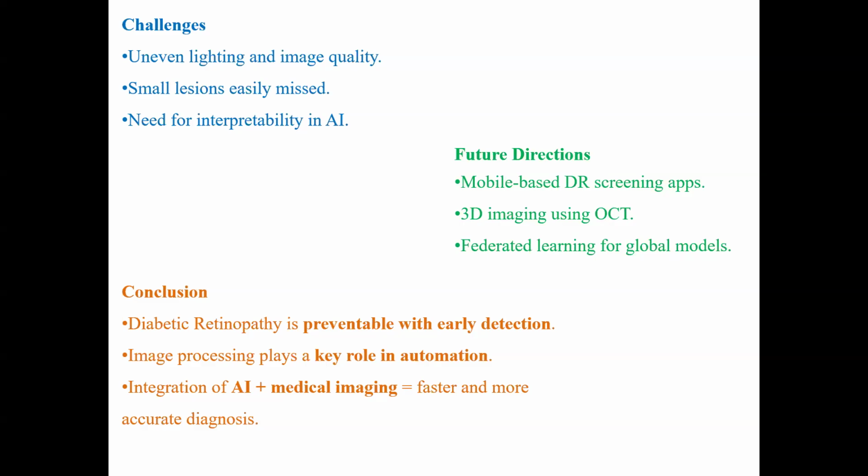And also, the need for interpretability in AI largely depends on the data set. The data set has to be accurate and large enough for performing accurate diagnosis and detection of the diabetic retinopathy disease. So now, the future directions.